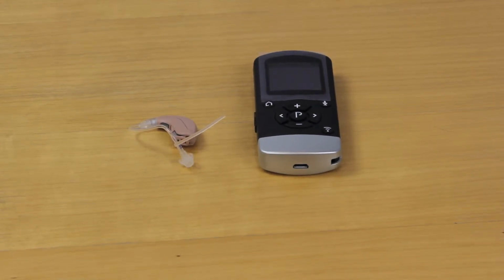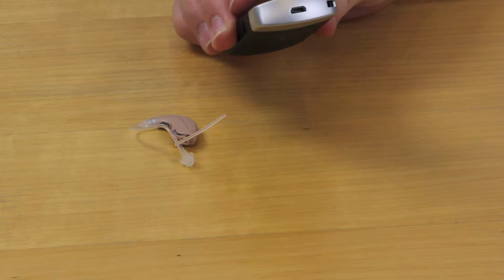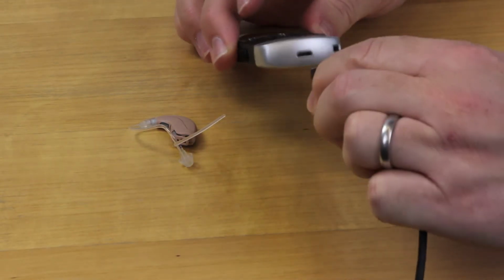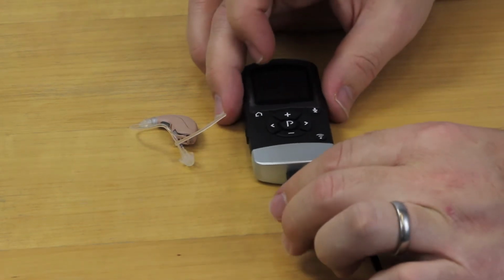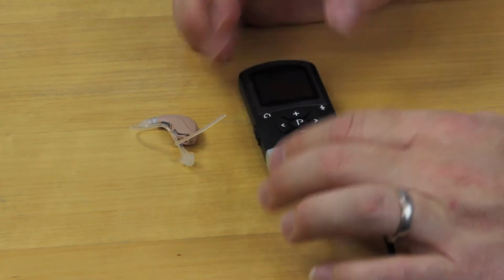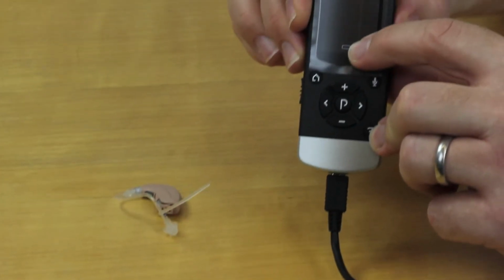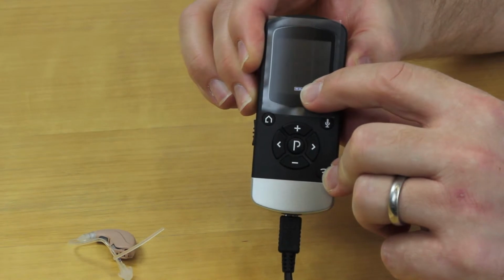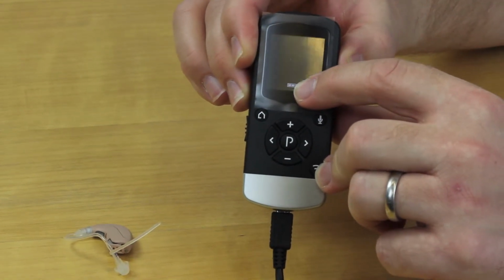Before using your Remote Control 2, you need to ensure that it is fully charged. Plug in the charging cable to the micro USB of the device and the other end to an appropriate power outlet. During charging, the bars in the battery meter will be showing 1, 2 and 3 bars intermittently. When fully charged, all 3 bars will be shown continuously.